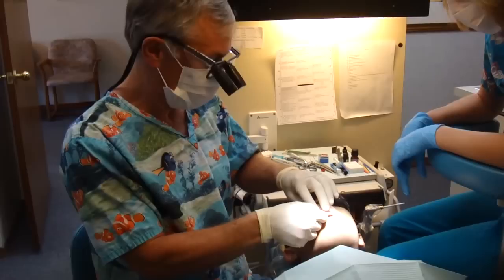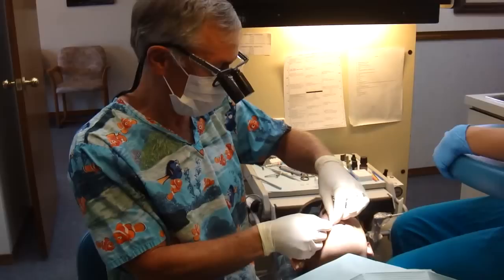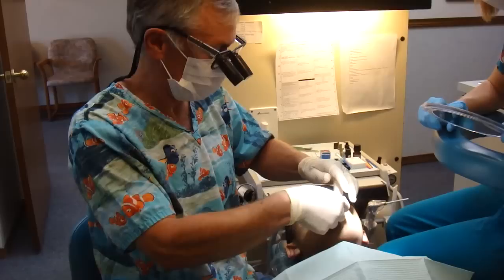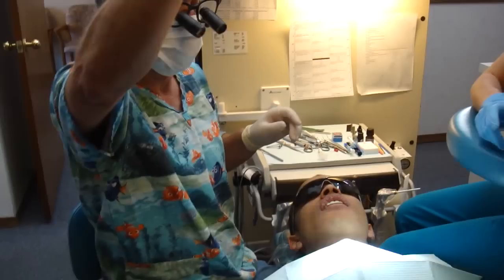These are not cemented on, so you have to be careful when I show them to you. I'm going to get you a mirror in a second, but you won't be able to really say anything because I don't want your tongue to knock them off. They fit perfect. So here they are, just kind of sitting there. They're not cemented in yet. Mo, take your sunglasses off. Remember, those are just kind of sitting there. You can't say anything.